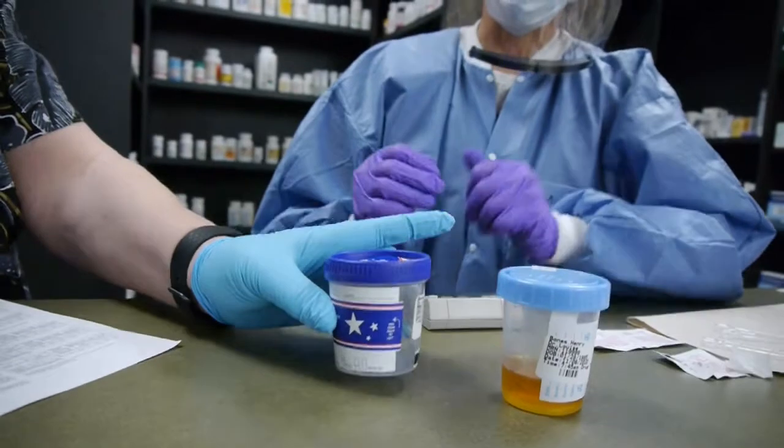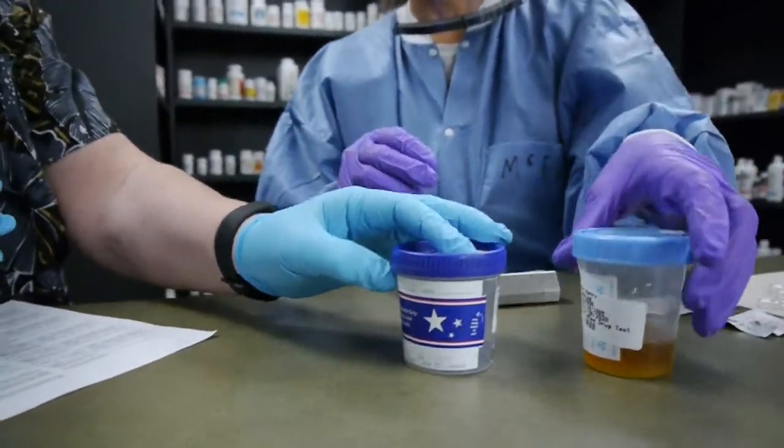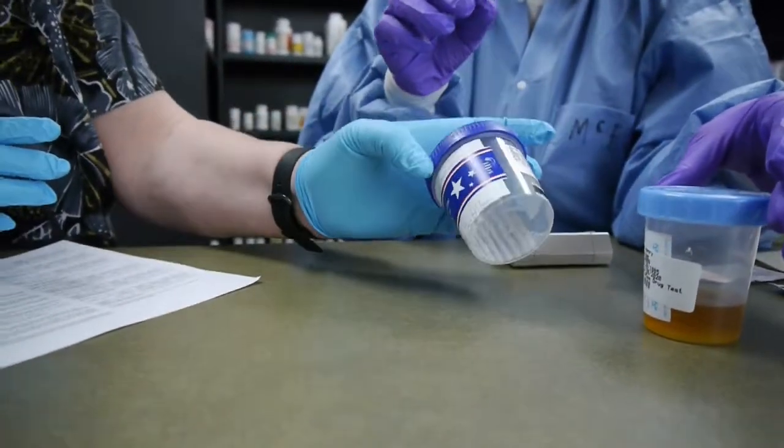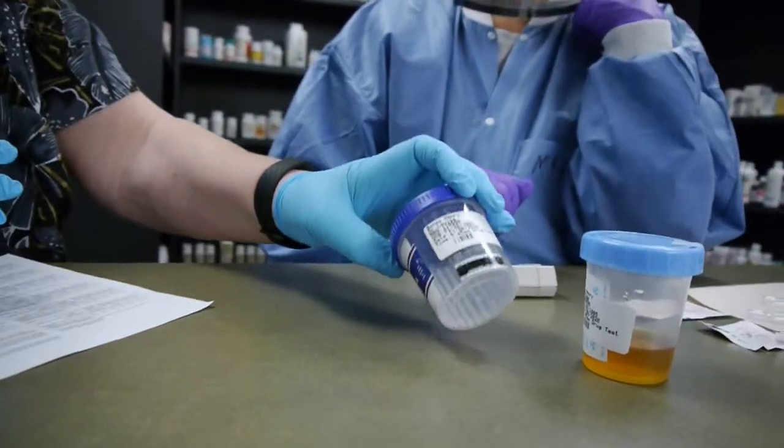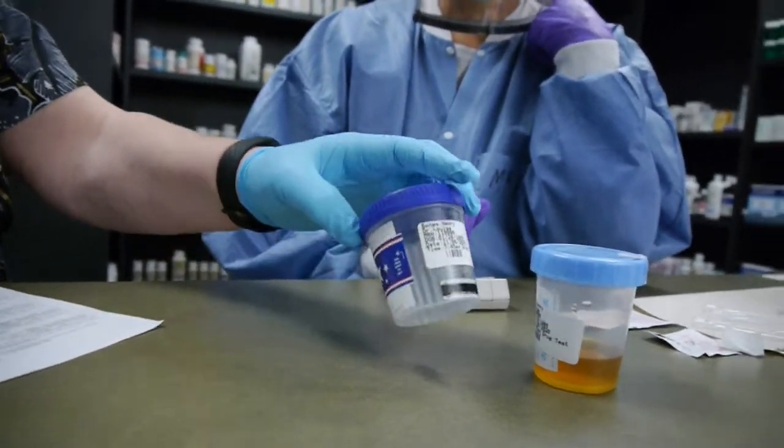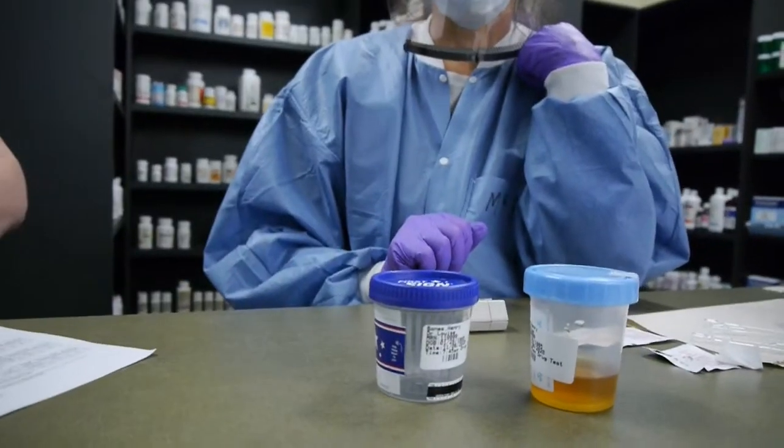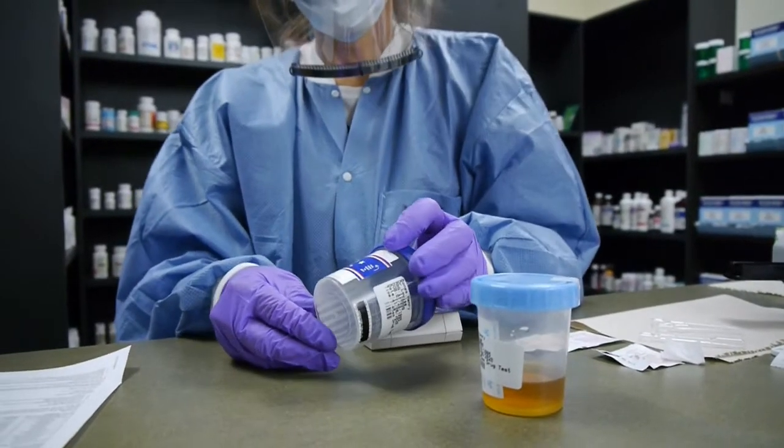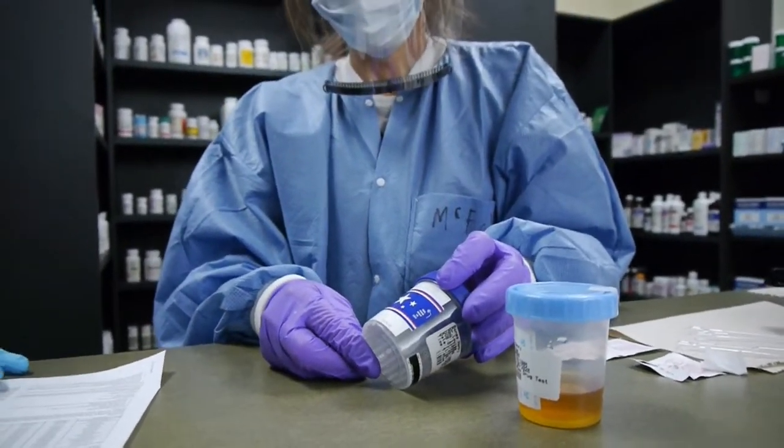You're going to take urine from the container and make sure that you're labeling your test kit appropriately. Always follow your standard operating procedure. It says that you need a minimum of 30ml.